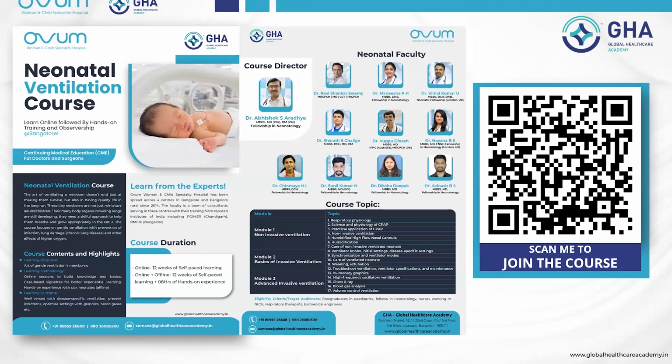What is the role of point of care lung ultrasound in bubble CPAP? Lung ultrasound while giving CPAP. I don't think it has much role in the management of babies with CPAP. It can help you to make some diagnosis before you get an X-ray. Maybe you can know whether it is a pneumonia or an RDS or a pneumothorax. So apart from this, I don't think lung ultrasound is going to help you. Most of the time clinically you can make out whether it's pneumonia, RDS or pneumothorax. So lung ultrasound is just an add-on.